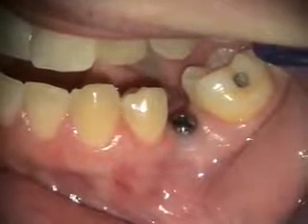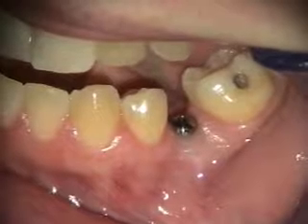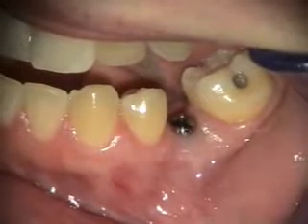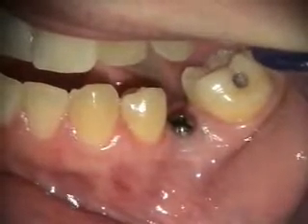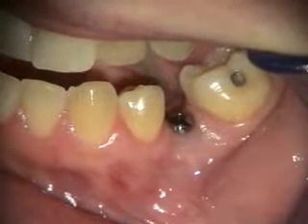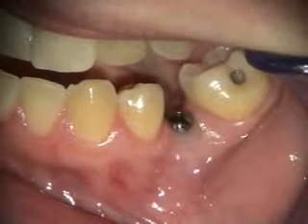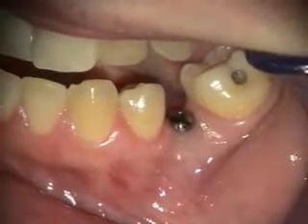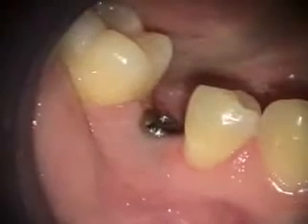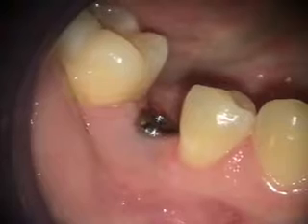In this case the ridge was thin and the site is small mesiodistally, so we used a 3.0 millimeter implant. We'll take a look at the x-ray. We'll look at the number 20 and number 29 site. Here's the number 29 site and we'll look at the x-rays next. She's ready to go for the restorations.